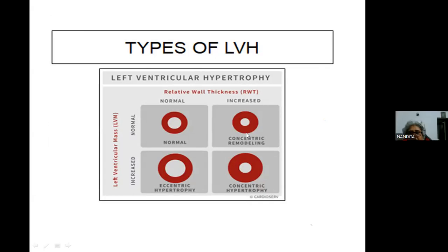Sir, I think the confusion is, if I give a report, do I say this is LVH, or if I get a report, can I say this is LVH? That's what I'm trying to say: if I'm really looking at LVH, forget about a criterion of more than 12. If we look at about 12 to 15 millimeters, a better cutoff, then we possibly say that definite hypertrophy is present. And the word which people often write is mild concentric LVH. This word mild should never be there. You should measure your septum and posterior wall. They should be at least more than 12 millimeter. And if they're 15, they'll be really good enough to talk about hypertrophy.